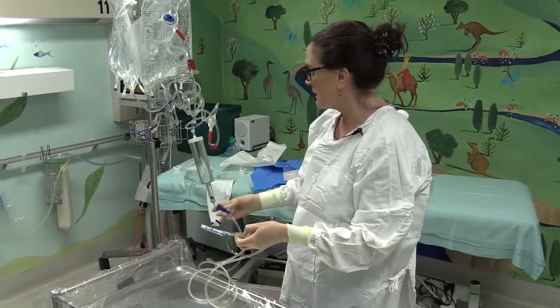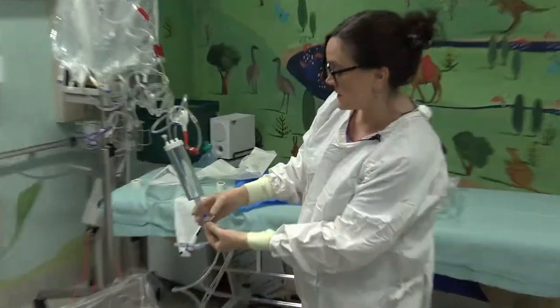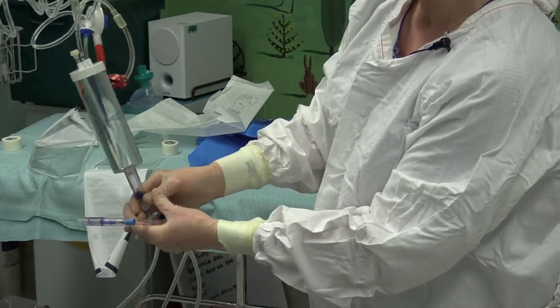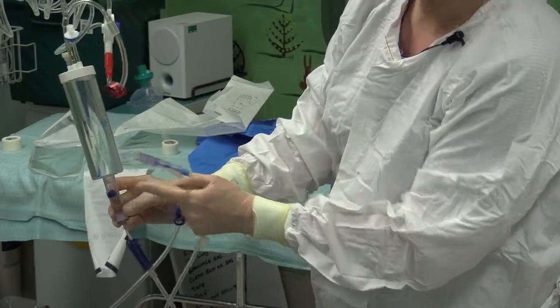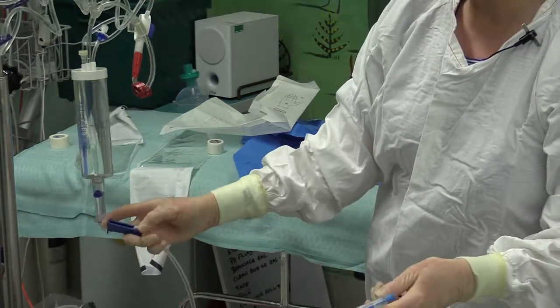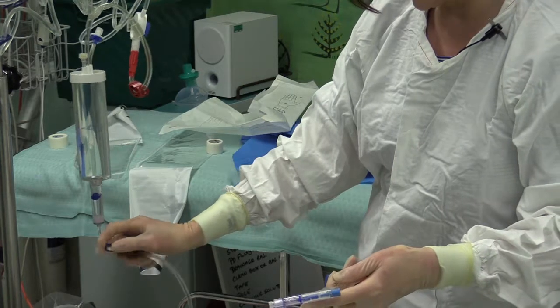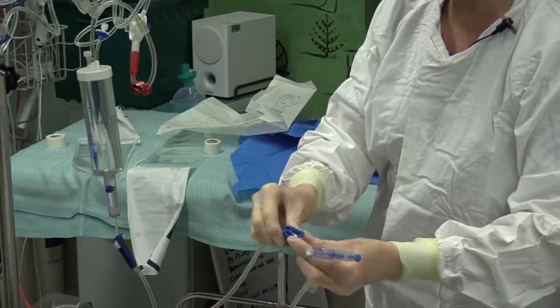So to do that, I need to make sure that the chamber is full of fluid. So to do that, I will squeeze it twice or 3 times until the ball valve is released and sits at the top of the fluid. Then I will release my roller clamp and release the blue clamp.